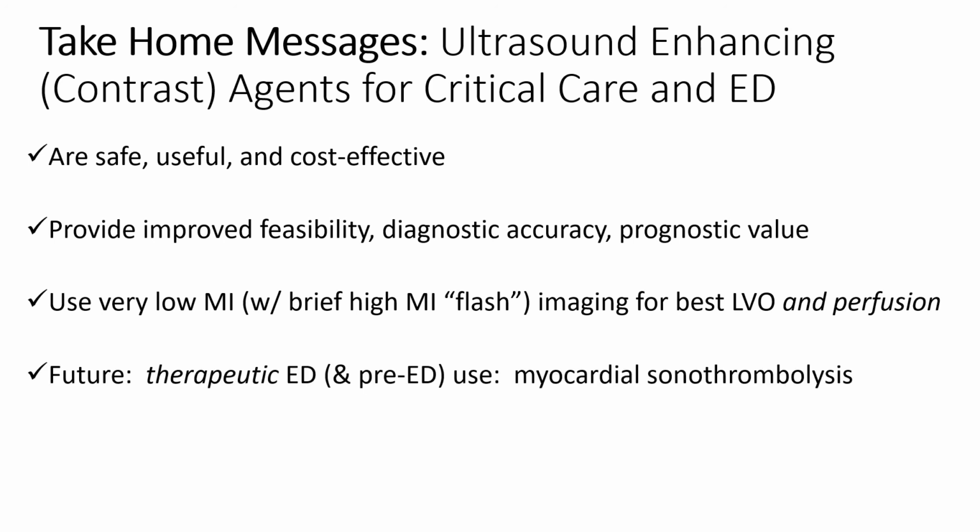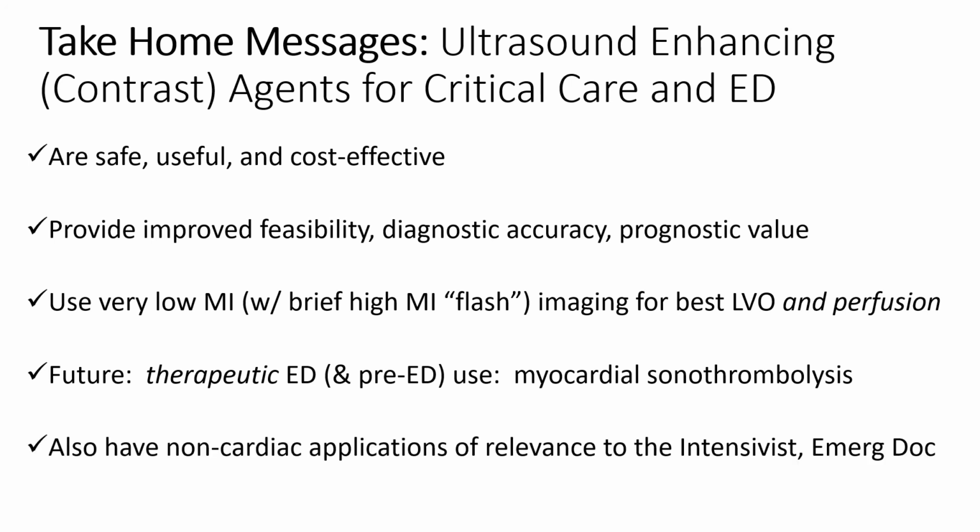The future is very exciting with the therapeutic use of contrast ultrasound in the emergency room or even before patients arrive in the emergency room, and this is termed sonothrombolysis. It's important also, of course, in the critical care and ED settings to recognize that contrast-enhanced ultrasound also has non-cardiac applications of relevance to the intensivist and the emergency doctor.